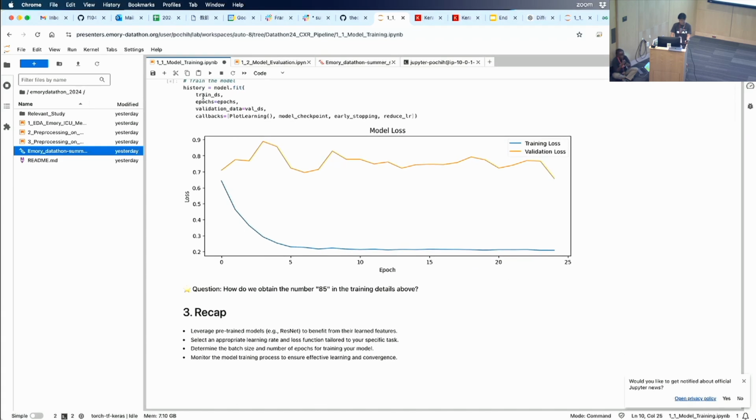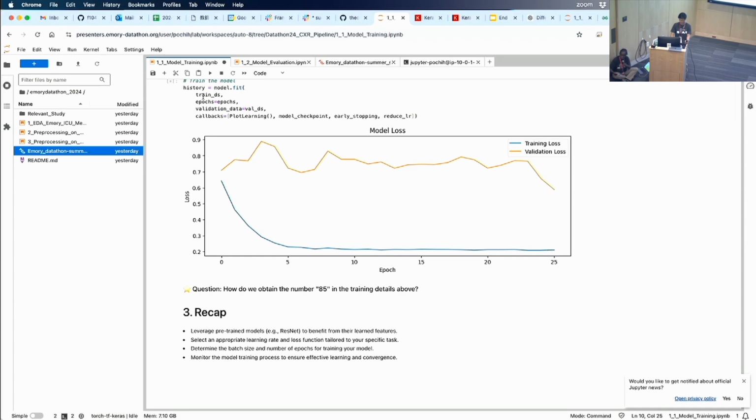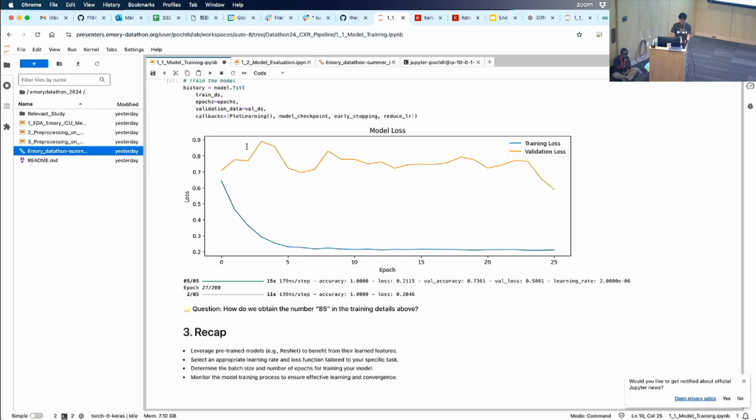And you will have to specify your hyperparameters, including your learning rate, because if you take very big steps, you're not going to learn everything. But if you take very small steps, it's going to take you forever to get to the end.